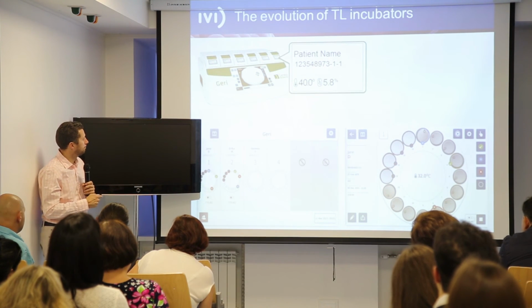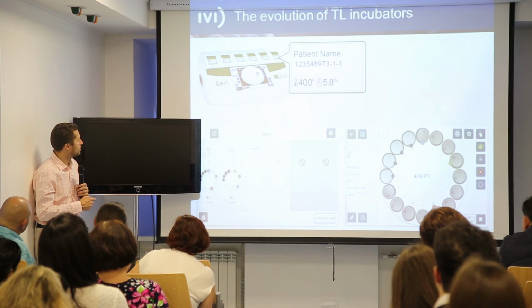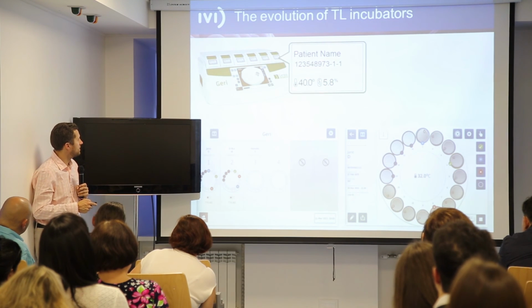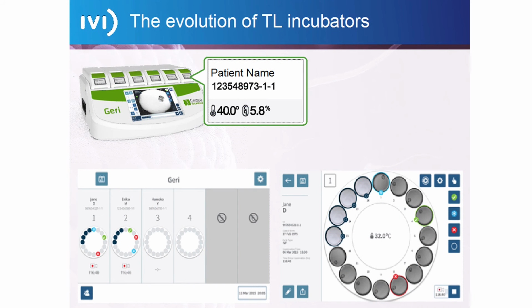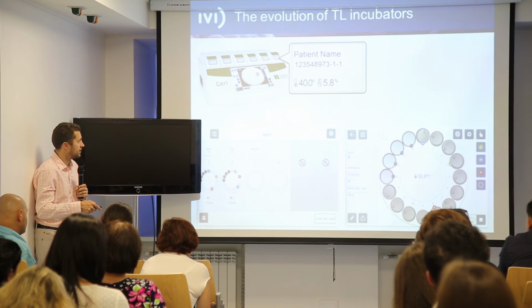In every patient incubator with a camera, you have the patient name, the temperature, the CO2 concentration. You have all your patients in the same screen. You can go in detail to every patient, check each one of your embryos, and put what is the final destination.